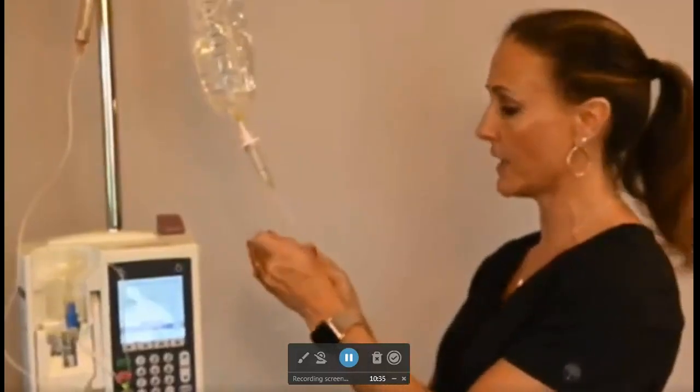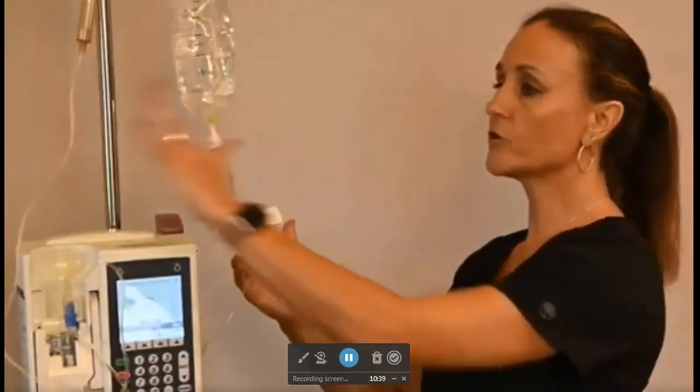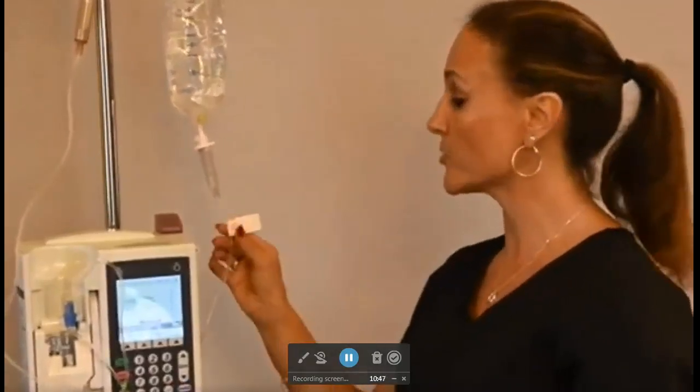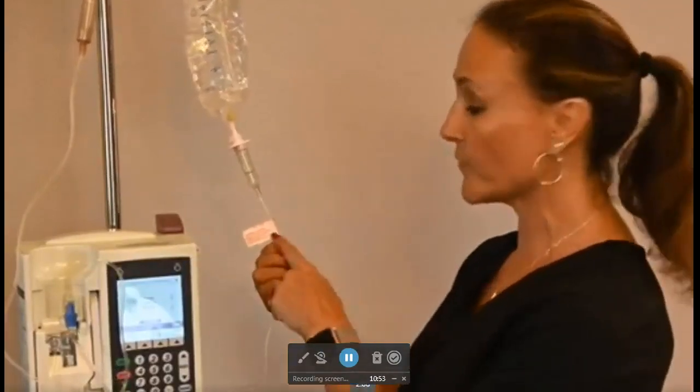the tube. Usually you will see that they'll just peel off the end. I would come put it on and just put it across itself. All tubings need to be labeled. If they are not labeled, then we usually will have to discard them, and then we would have to get new tubing. So please make sure when you hang any kind of tubing that it is labeled, and you need to be looking when you go in your patient's room. Is it time for me to change the tubing or not?